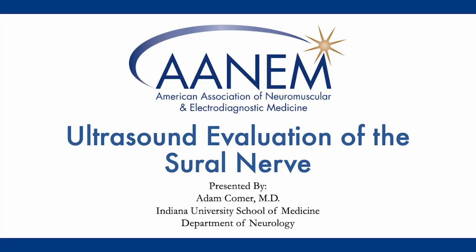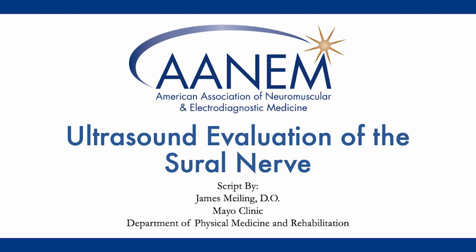Welcome to the AANEM Neuromuscular Ultrasound Instructional Video Series. This demonstration will review ultrasound evaluation of the sural nerve and relevant local anatomy.